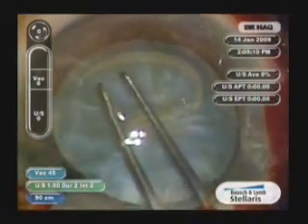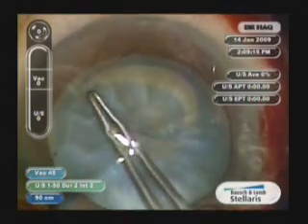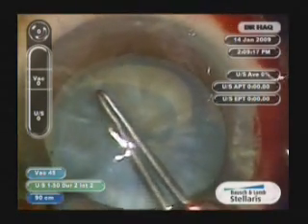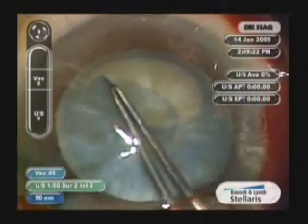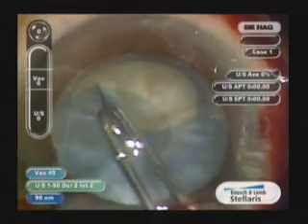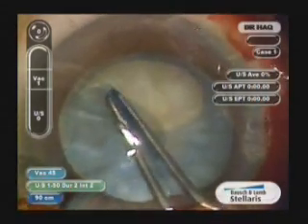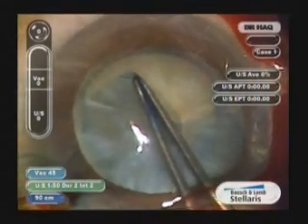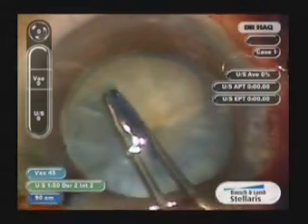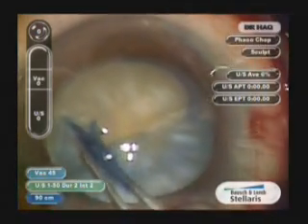It is essential to grab the capsulorhexis close to where the tear is directed and to pull backwards away from the tear area — you will find that the rhexis will then start turning in. It is better to grab closer to the area of the tear juncture.